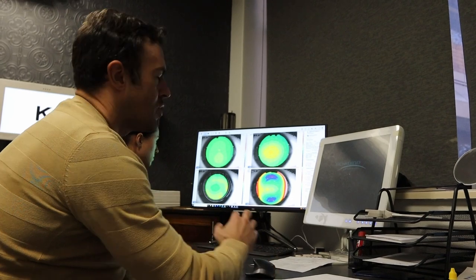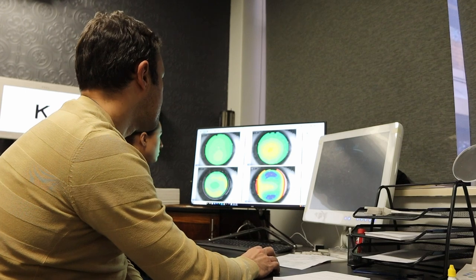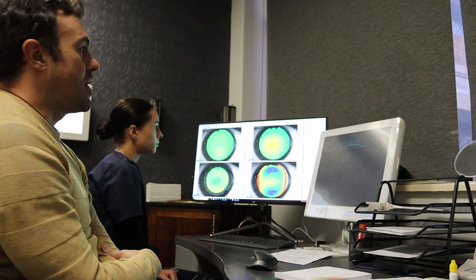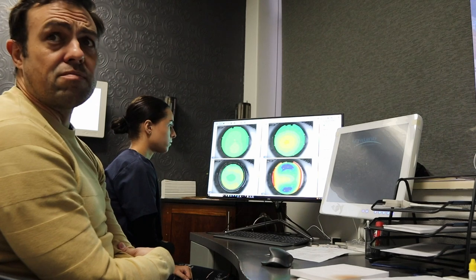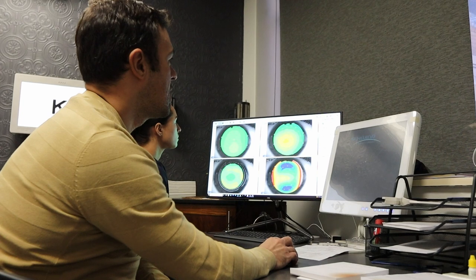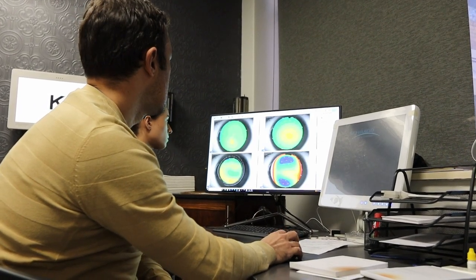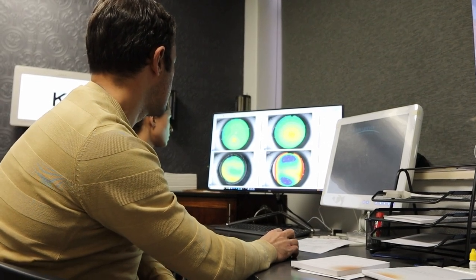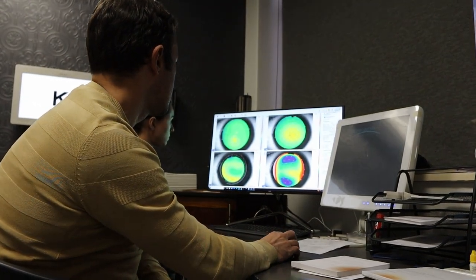And that points towards something that we call keratoconus. So you've got keratoconus grade 1. And it's probably not influencing you that much. In the past, as I said, we would not have touched your eye. But now with technology, we actually can. We just need to add a second procedure at 6 weeks that we call cross-linking. And on this side, very similar. Still thin at the bottom, and then the epithelium is thin.